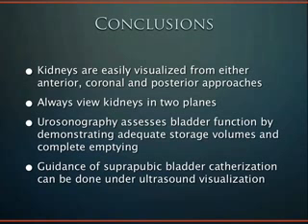Think about using ultrasound whenever you think about the bladder, and you can see the storage volumes, you can see the post-void residual, and of course guiding suprapubic bladder catheterization. Like any other time when we take a sharp object and we put it into somebody's soft tissue, we can use ultrasound guidance for that. Thanks.